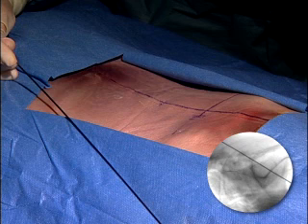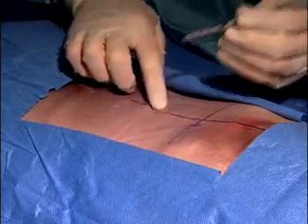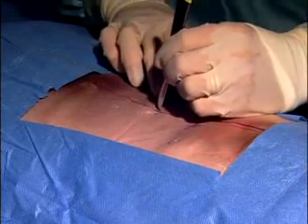Typically, the entry point will be at the spinous process of the vertebral body, 1 or 2 levels above the level to be treated, such as L3 for a L5-S1. A small midline stab incision is made to accommodate the access needle.